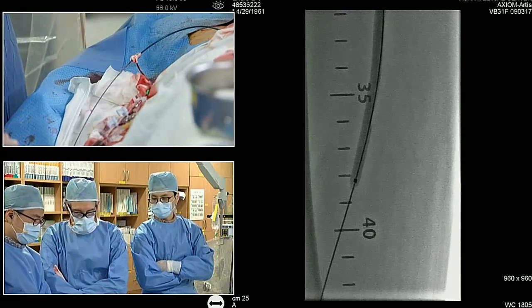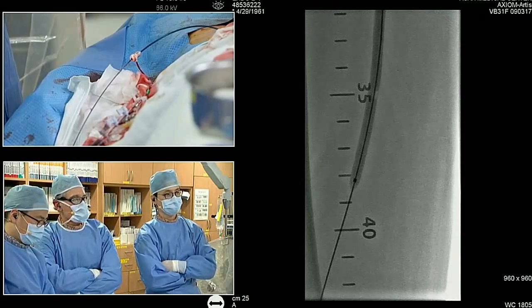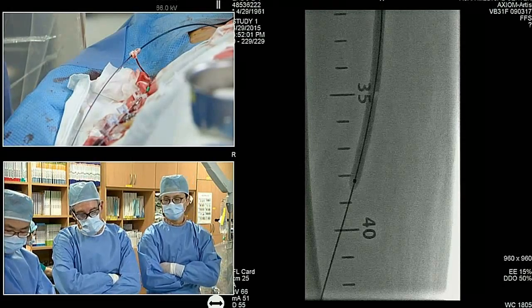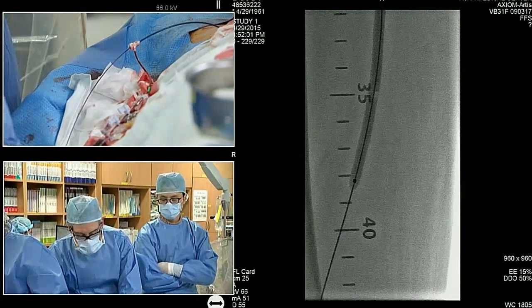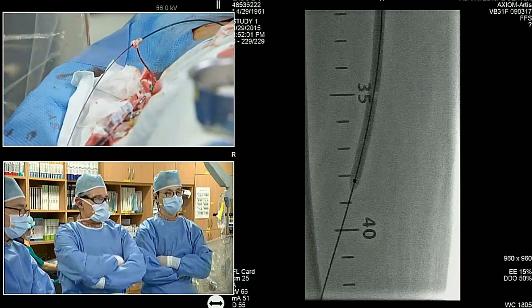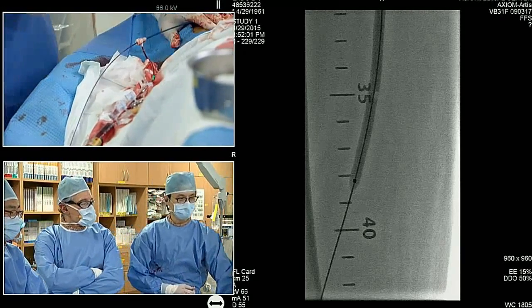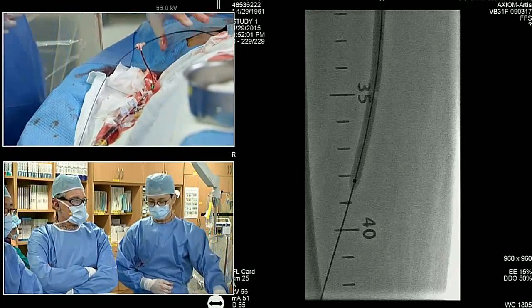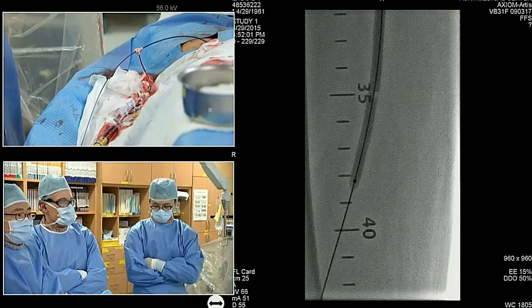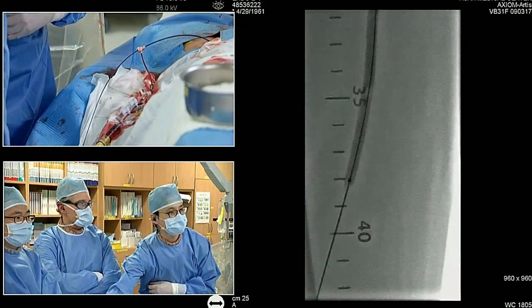Go slow. Yeah, so we're going to go no more than 6. The patient's feeling it already. And remember, this is a 6 millimeter. The pre-dil was a 5. Come down a little. So you can hear he's feeling it. So I've backed down to 4 atmospheres. And the timer is on, yes. So it's a little boring here while we do this, but there is belief that drug transfer is improved by more prolonged balloon inflations.